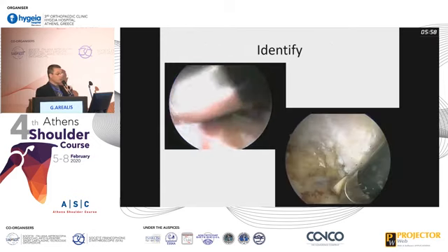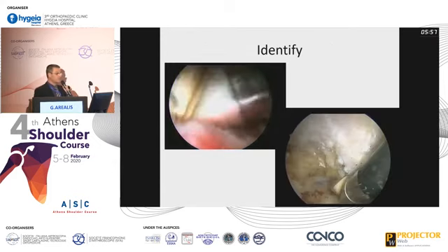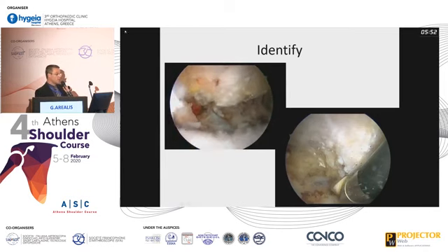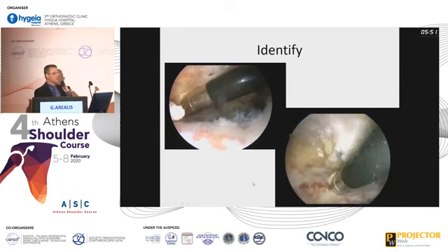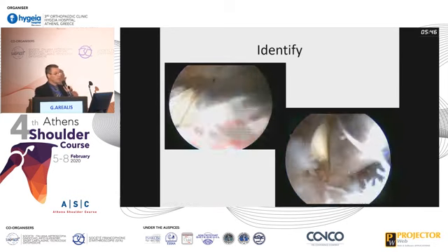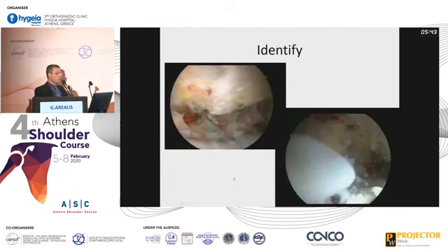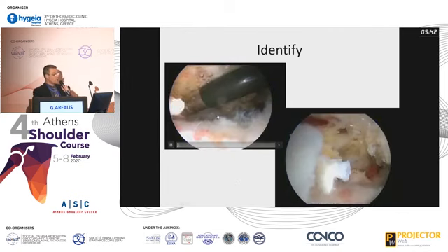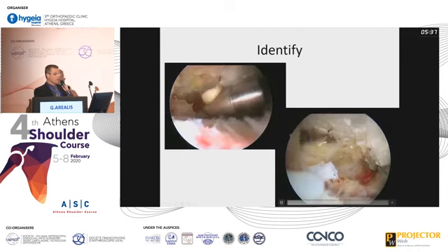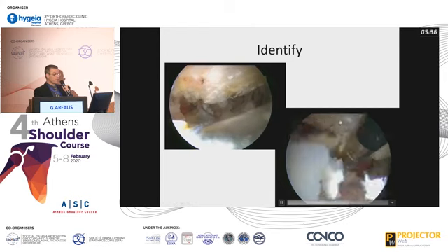So what do you do? You need to identify the AC joint. That's the first step. Starting from the bursal side, I do this with the standard 3 arthroscopic portals. I do not use any specific or different ones. So you view from the back, you go from the side, use the wand to go and find the AC joint, and then you push on the clavicle on the bottom right and you will see the clavicle moving.